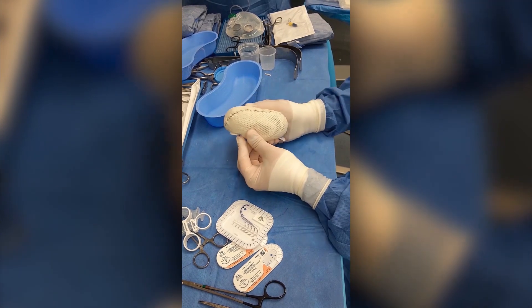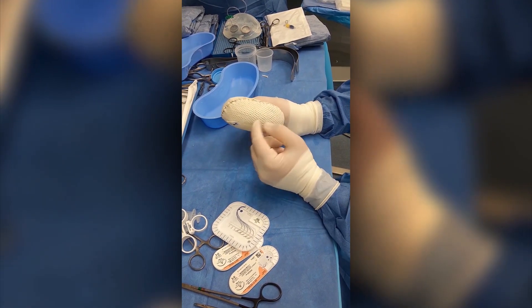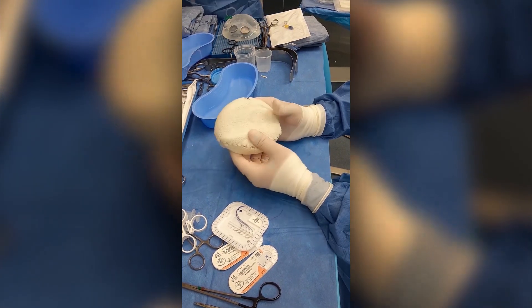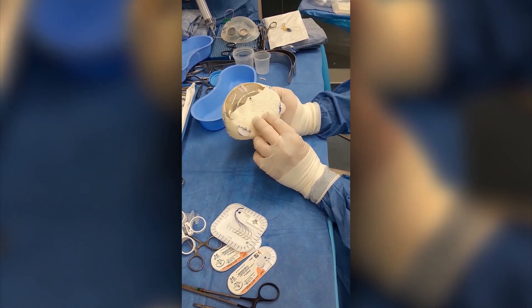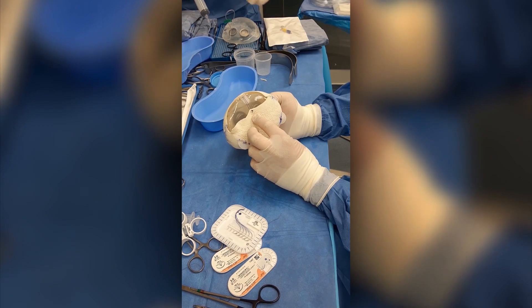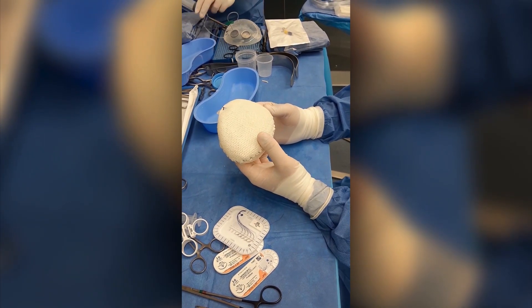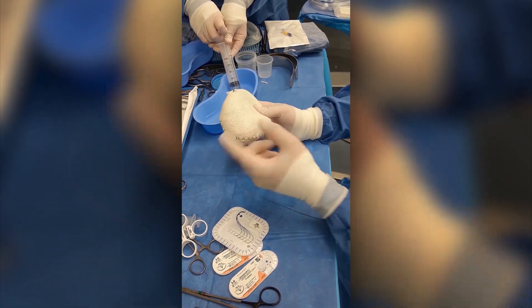The fact that this is meshed, we've got a drain on this device here underneath. This is the Aloex device and you can see that drain will still be able to pull fluid through this meshed material. So this is basically the final pita pocket, and this can accommodate — this is a 400-something cc device. These exact same size pieces will actually go all the way up to 650 and even a 700 cc device. You just have to tailor how much you cut off the ends.